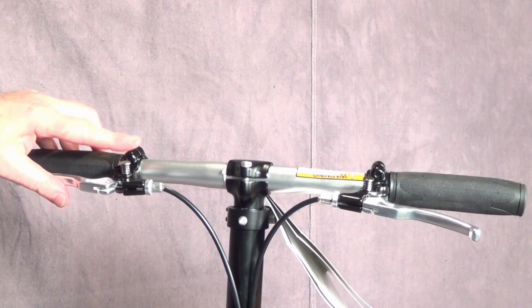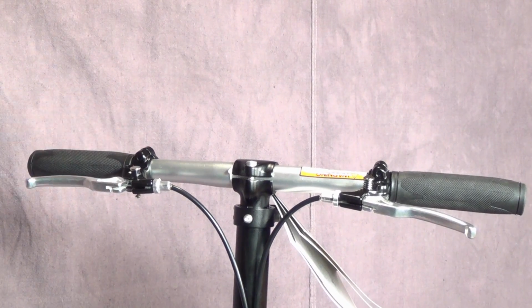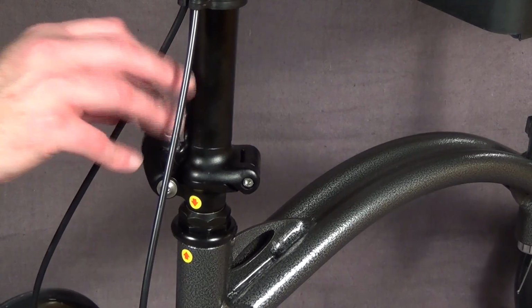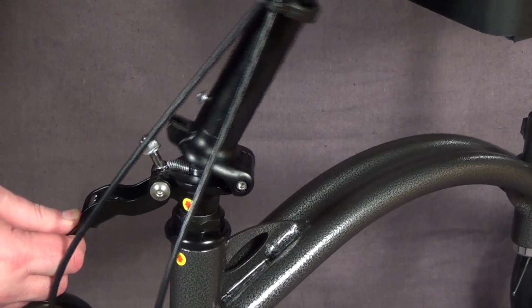Squeeze the brake levers and push down on the brake lock buttons. This will help prevent excessive movement during assembly. Unlock the tiller and fold it down.